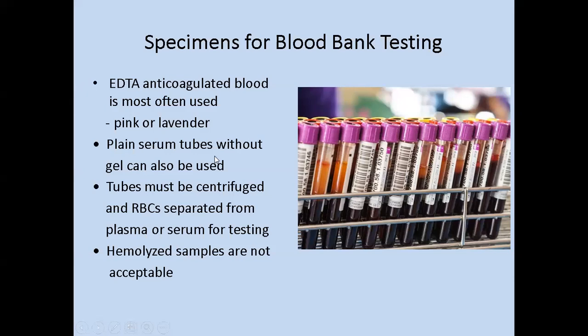The reason being is when we're doing blood bank testing, we're looking for agglutination reactions of immune complexes forming. However, if hemolysis results in our test system, that also indicates a positive reaction. It could mean that complement was activated, causing lysis of some of the red cells in our test system. So if we start off with a hemolyzed sample, it's not going to be good because we won't be able to detect any changes. So they're canceled and would have to be redrawn.